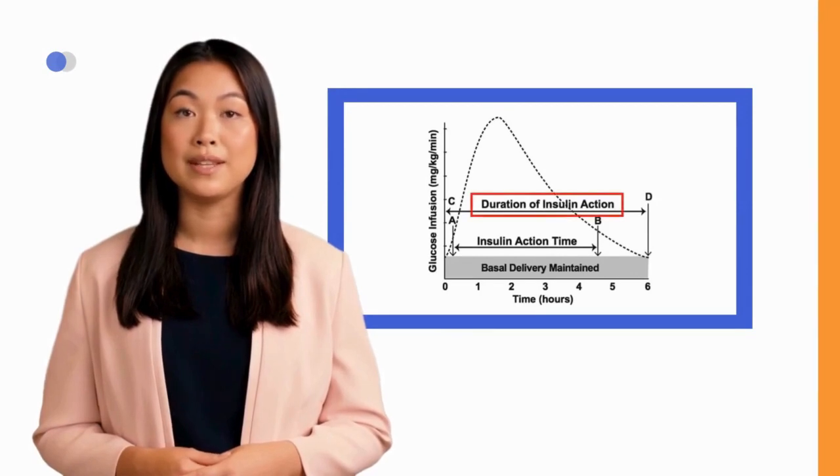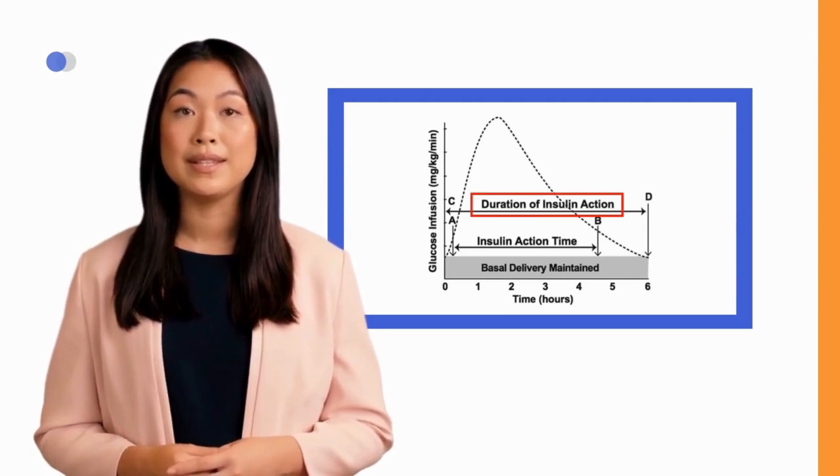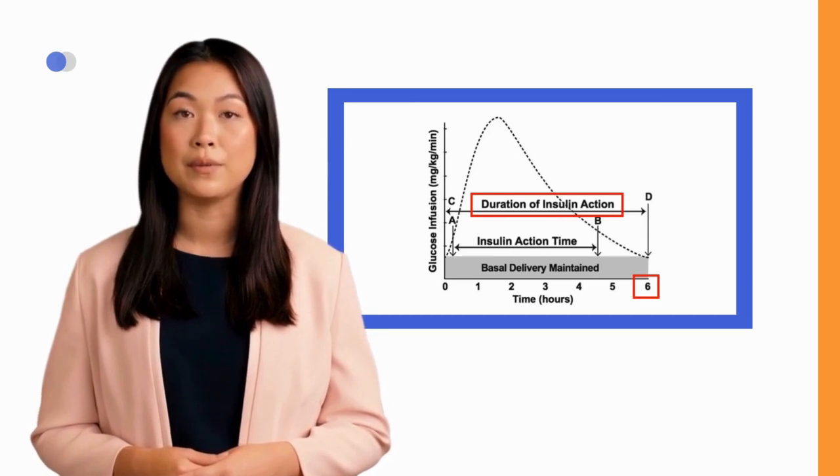The duration of insulin action in open-source closed-loop systems is typically longer than in traditional insulin models due to the consideration of insulin's long-tail effect. Most users prefer 6 to 7 hours. If you require a longer duration, check your ISF settings as they might be too aggressive. In general, the actual duration of insulin action does not differ that much between users.